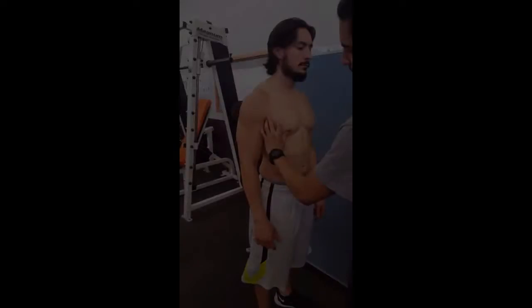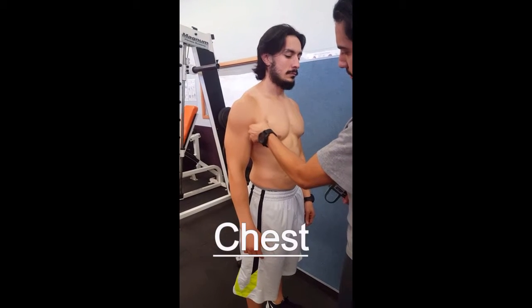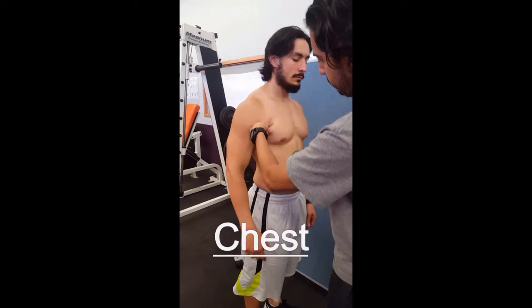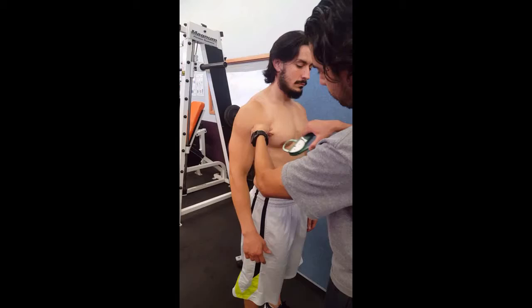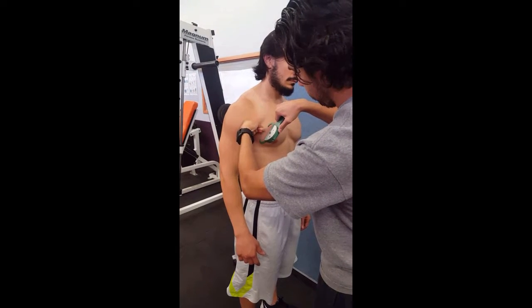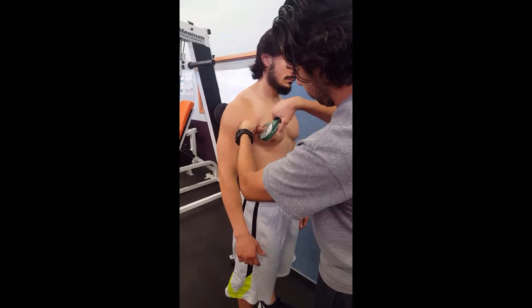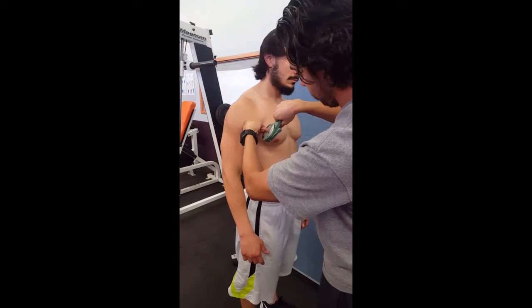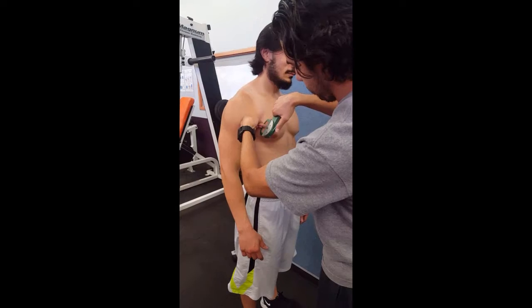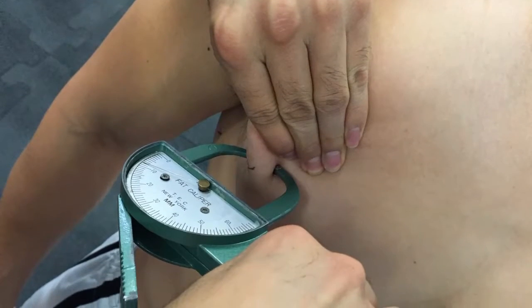Next up, we have the chest. The chest is a diagonal fold. It is one-half the distance between the anterior axillary line and the nipple for men, or one-third of the distance between the anterior axillary line and the nipple for women. For all measurements, you firmly grasp the skinfold between the thumb and the index finger of your left hand, one centimeter above the site to be measured.